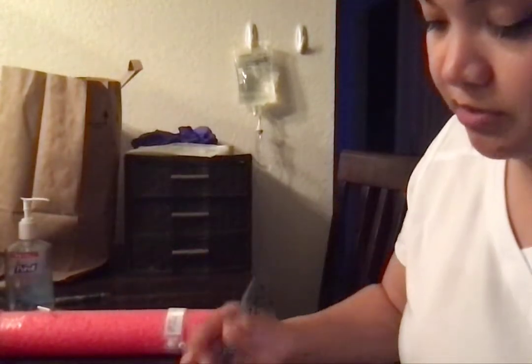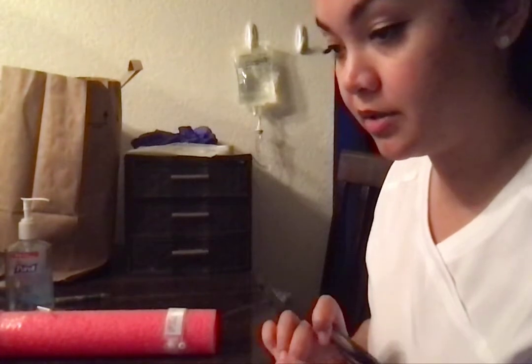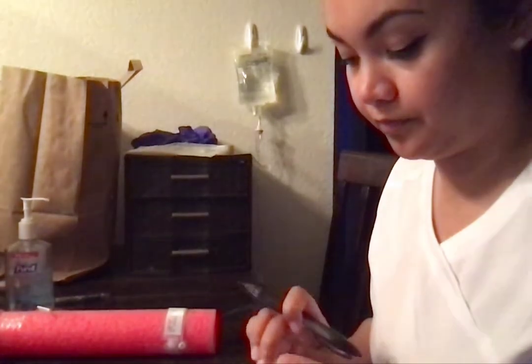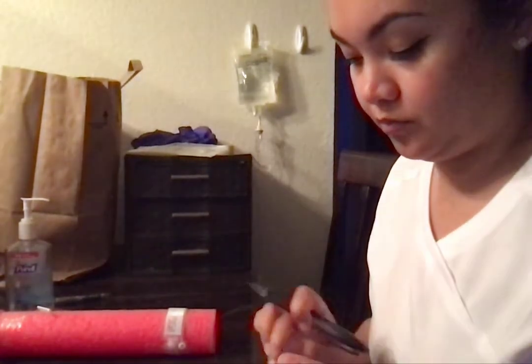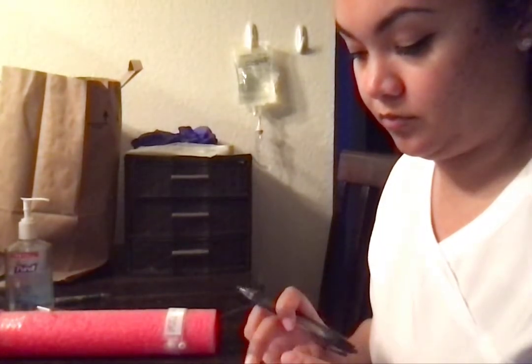I'm going to go ahead and write myself a note. 25 GTT per minute. And just to be sure that I have the math right, I'm going to do that a couple more times. Yeah, so I have 25 drops per minute.